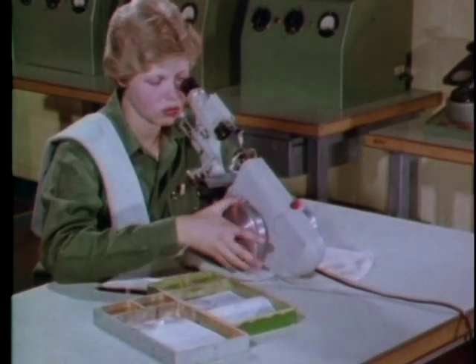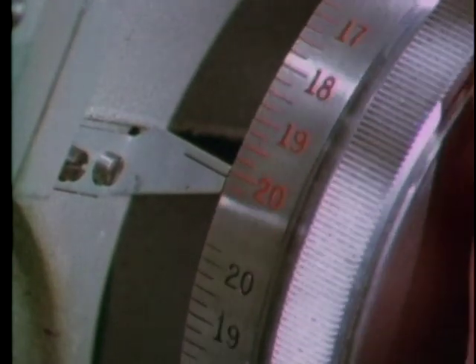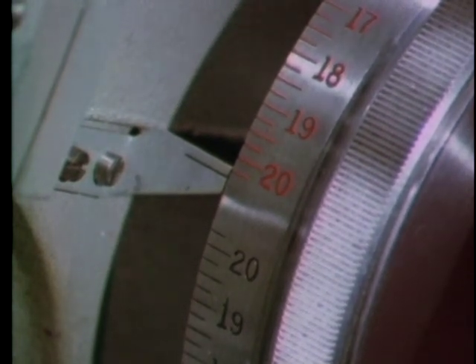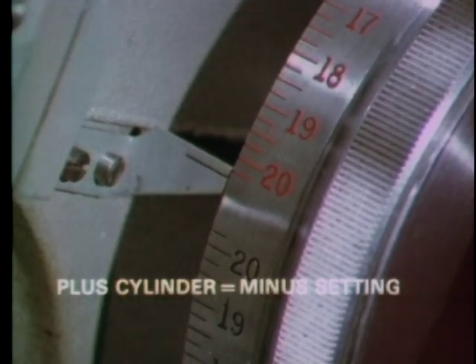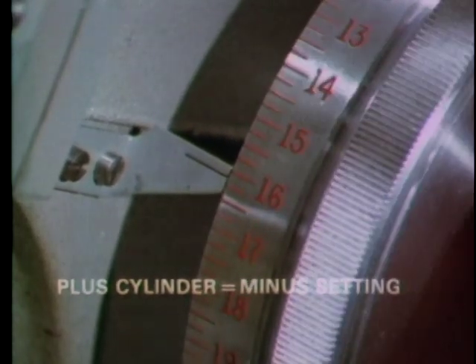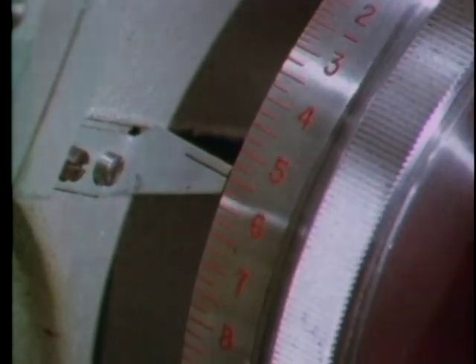First, we'll show the procedure for neutralizing a single vision glass lens working in plus cylinder form. Turn the power wheel to the full minus setting — it's not hard to remember, think opposites: plus cylinder, use a minus setting. Now turn the power wheel until one set of lines comes into focus. This should be the thin lines.